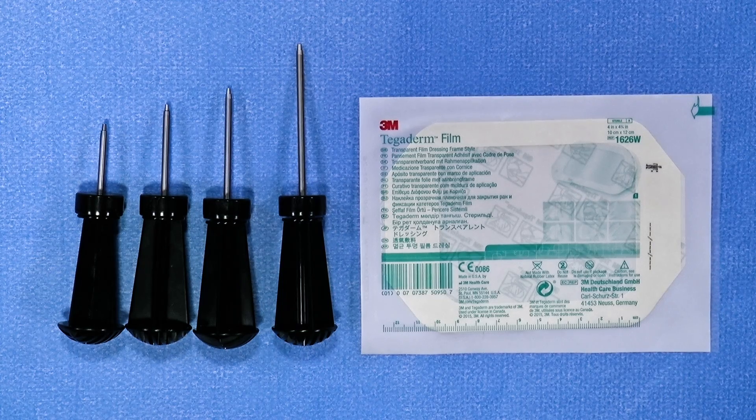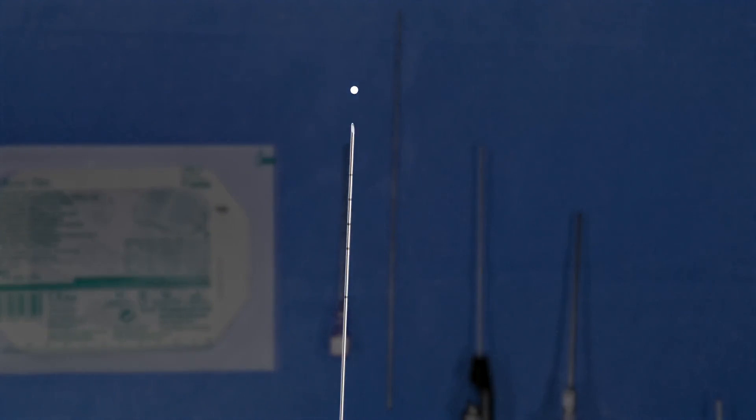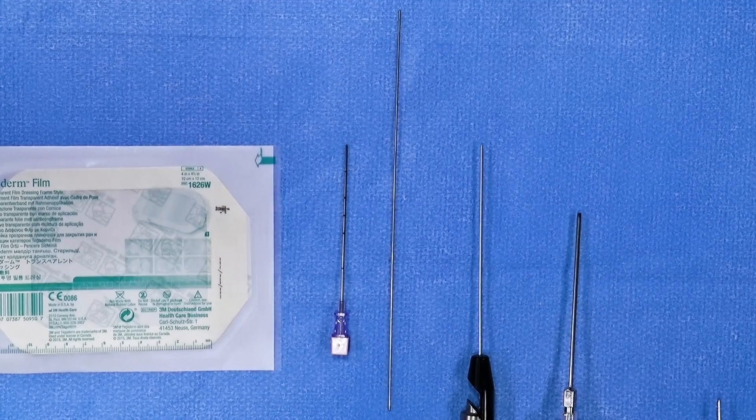Included in the kit, you have a Tegaderm adhesive that can be utilized with the cannula to maintain accurate and stable placement of the cannula during the arthroscopic procedure. The spinal needle included in the kit has graduated markers demonstrating the depth for capsular penetration. The included switching stick also allows for atraumatic switching of arthroscopic portals as needed during the procedure.